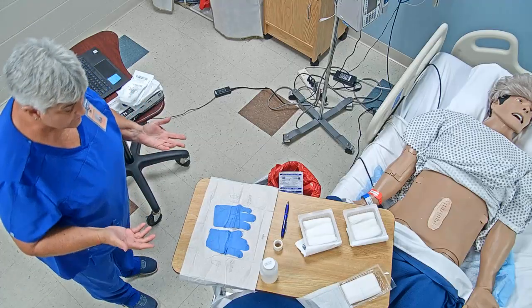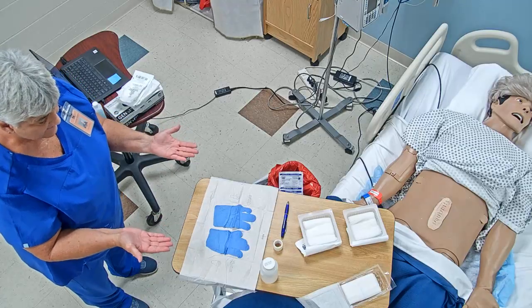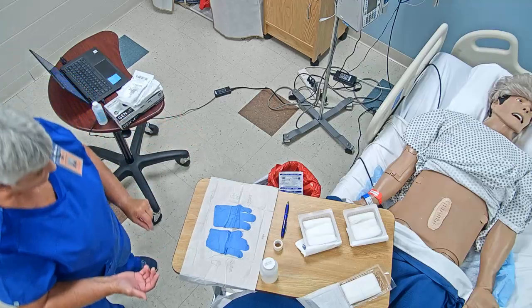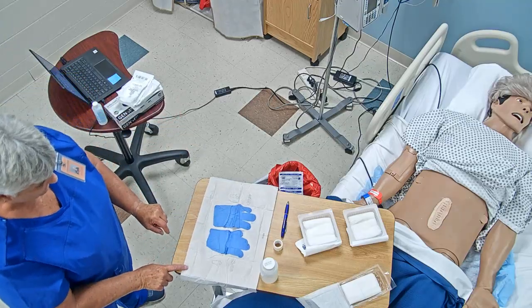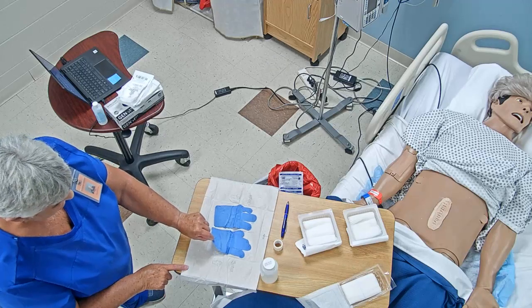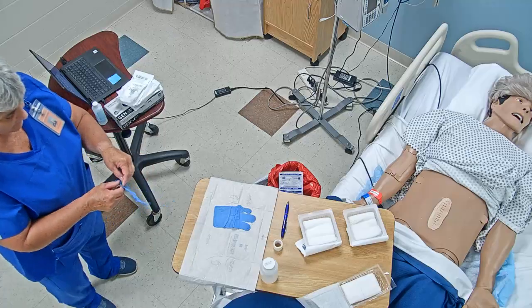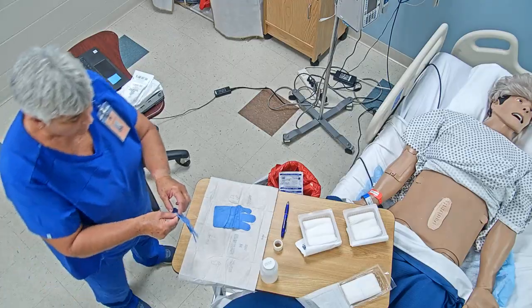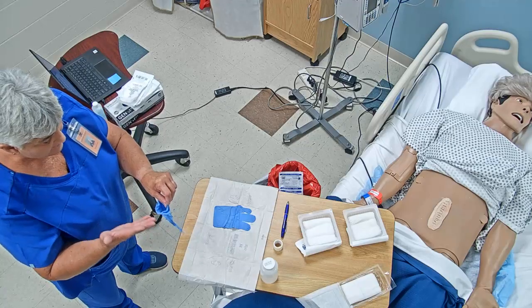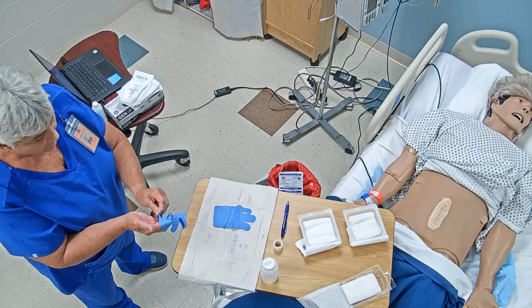Okay, so I've got to make sure the glove should be with the thumbs pointing out, and so this is your right hand, this is your left hand. So I'm going to go in, I can touch right here because I'm within that 1-inch border, but I'm away from there. So I'm going to touch the very edge of that glove, pick it straight up, pull it back, making sure I'm not crossing over that one. And with this one, this is the part of the glove that's going to be touching my hand. So I'm just going to work it.